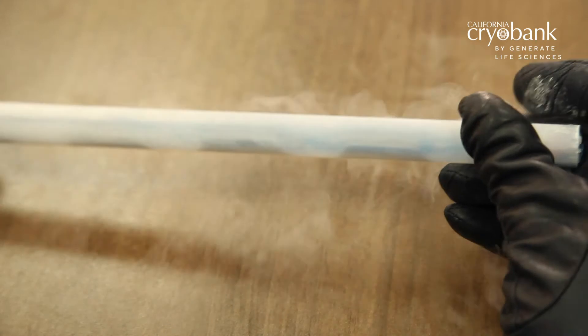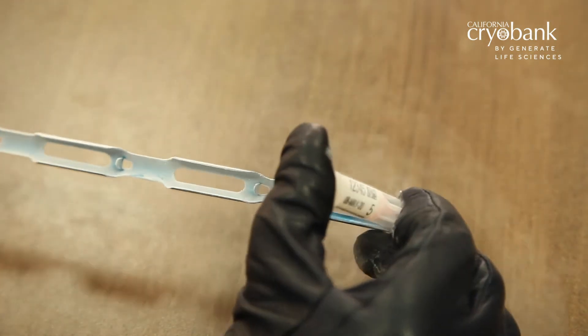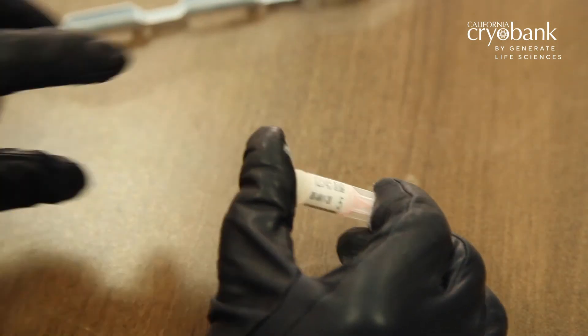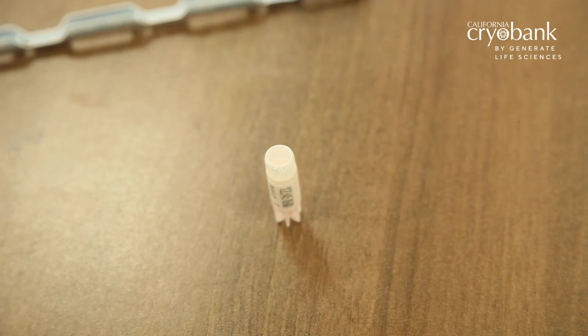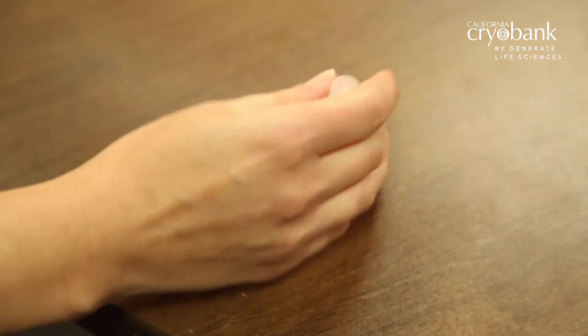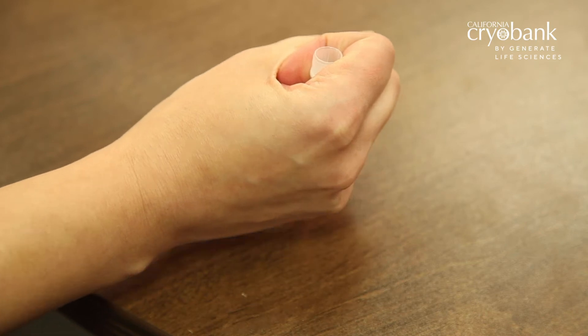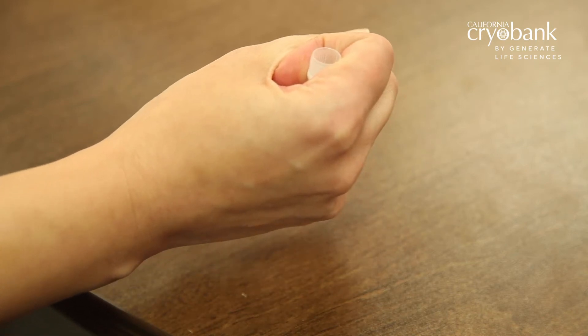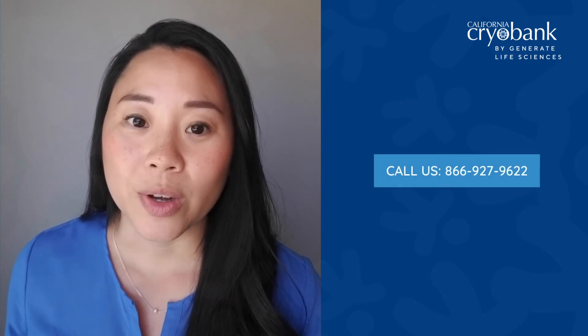When you are ready for the insemination process, remove the vial to be immediately used from the metal cane inside the tank. At room temperature, place the vial in an upright position on a flat surface for approximately 3-5 minutes or until the initial frost is gone. Hold the vial upright in your hands to bring the vial to body temperature — this should only take a few minutes. It is very important not to invert the vial during the thawing process. Please call us if you have any questions.